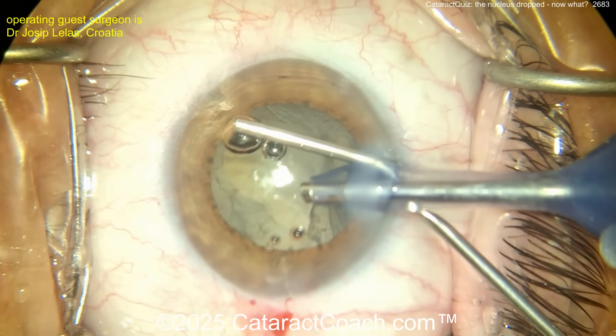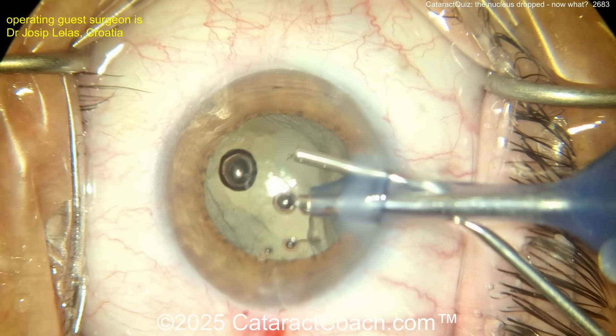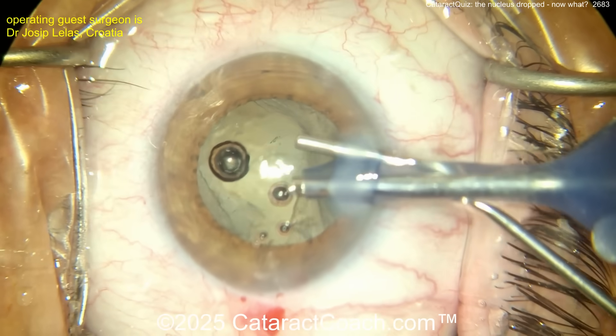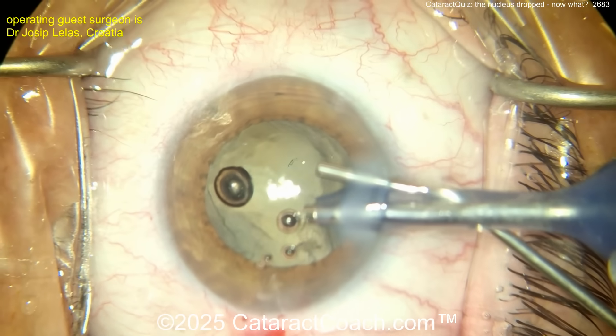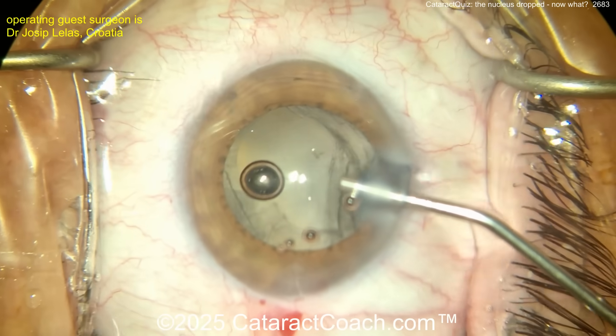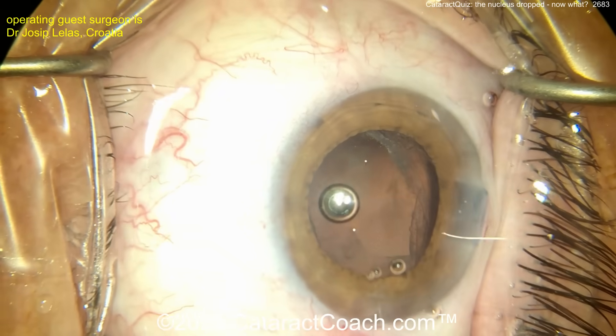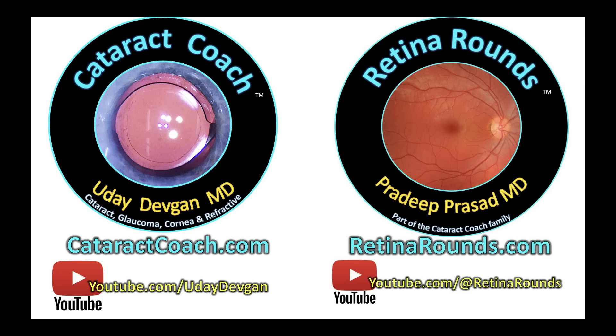There you go — injecting viscoelastic, interestingly through the main incision instead of the side port. Maybe that's because a larger 25-gauge cannula instead of the typical 27-gauge. Send to your vitreoretinal colleagues — that's the answer. The answer to the cataract quiz is: send this to your vitreoretinal colleagues. Share the love and the liability with the retina folks. Everything will be okay for the patient, and that's why you should check out retinarounds.com, our sister channel.